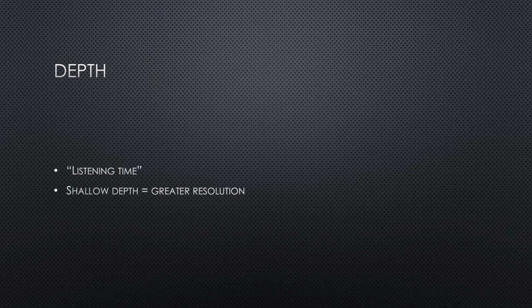So a couple of key things to know is that shallower depths give greater resolution. In fact, if you listen to the probe, when you move the depth up and down, you'll hear the probe pitch up and down as you change depth up and down. So ideally, you want to make sure that you set depth appropriately. Usually you want the depth to be set just past the structure you're intending to image.